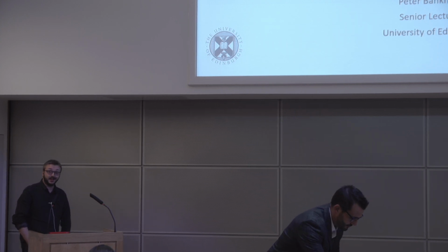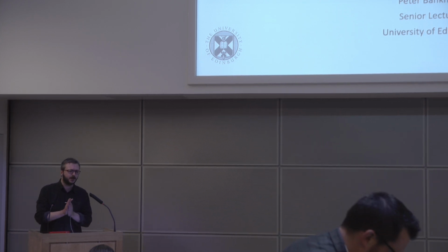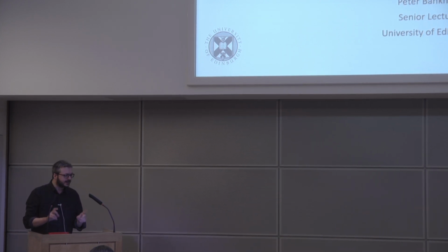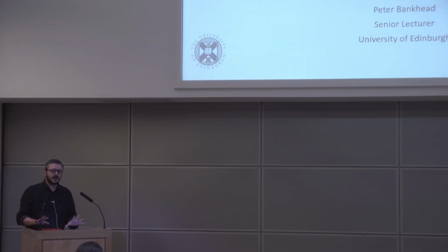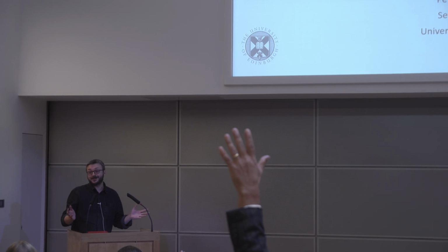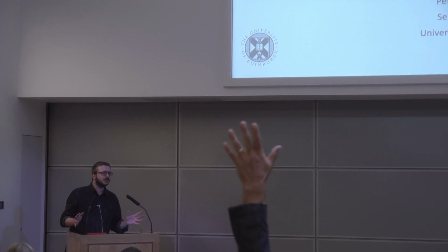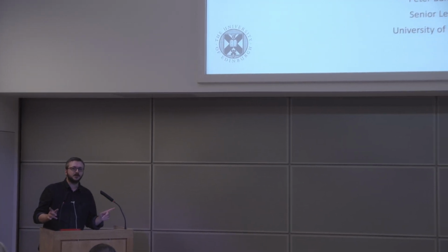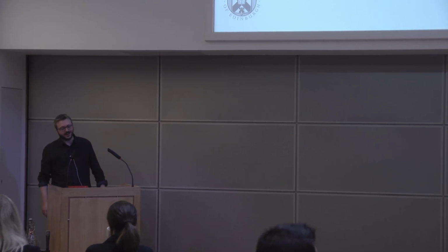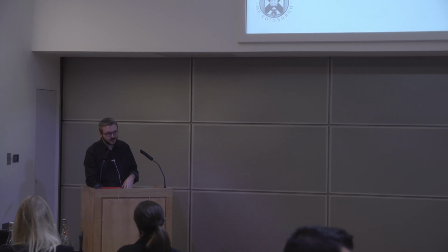Thank you very much. Thanks to the organisers and to you, Florian, for the invitation to speak here. At the risk of testing that hypothesis too early, has anyone used QuPath here? Some people. Do people here work with images very much at all? With other software then? Okay, good to know. That's fine. So I'm going to talk to you about QuPath, and I'm going to show it to you a bit during the presentation today.